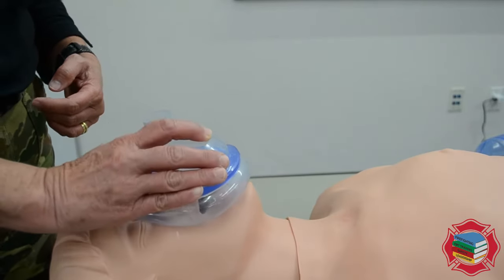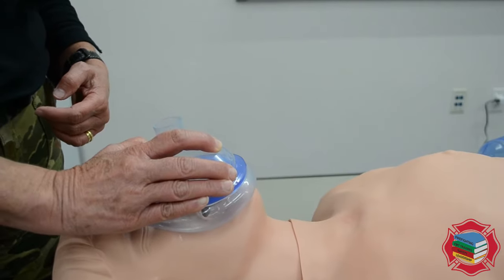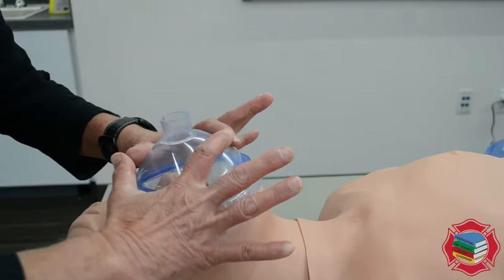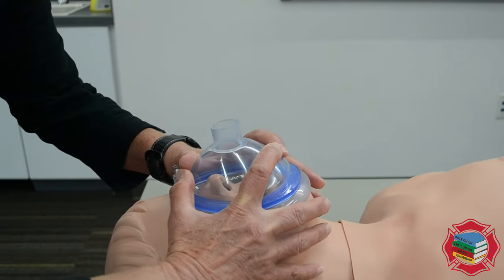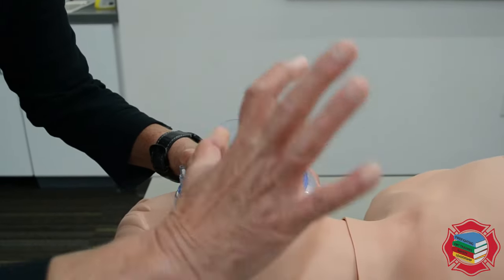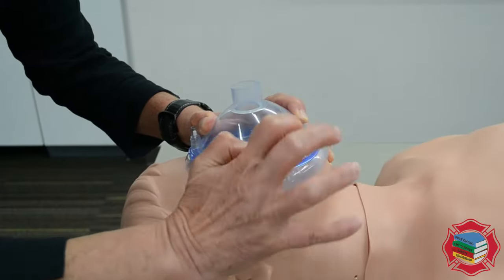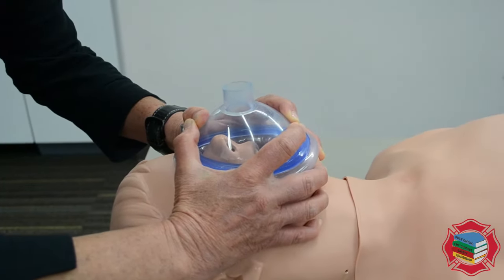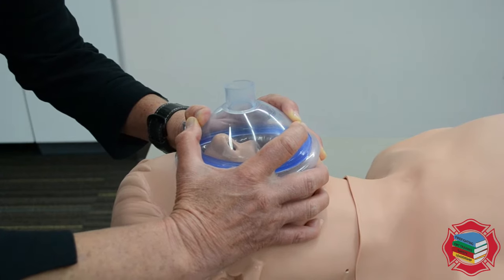Then march it down to the cleft of the chin. If you're gonna hold this mask on the patient with two hands, this would be called a bilateral CE clamp. Here are my C fingers, here are my E fingers, and that would be the same on the other side — a bilateral CE clamp.